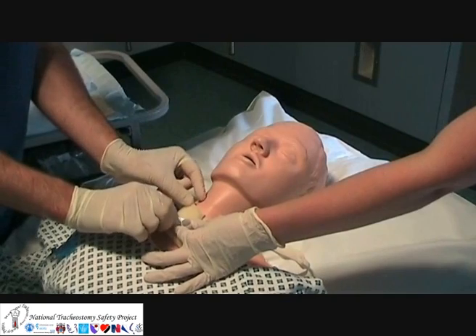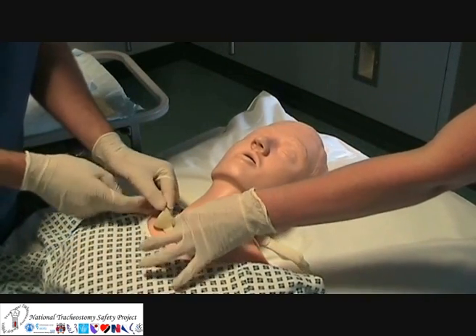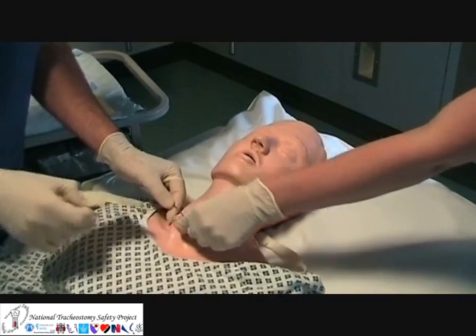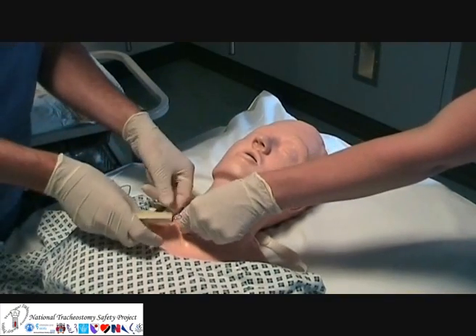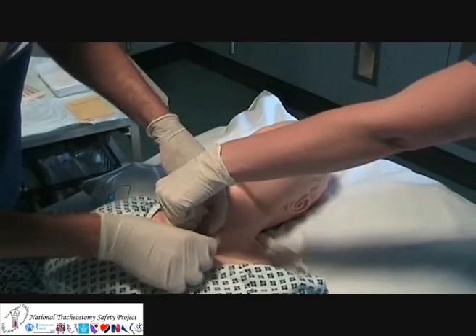Changing a dressing is a two-person procedure — one to hold and secure the tube, and the other to change the dressing. This is a good chance to inspect the stoma for any signs of infection and to clean if necessary, before reinserting a new clean dressing underneath the tracheostomy tube.